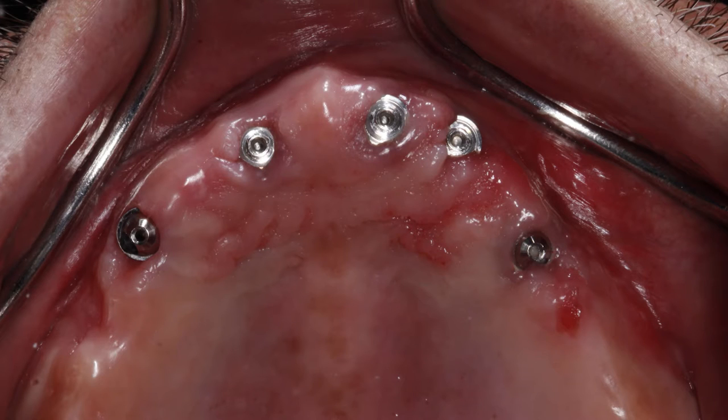This week, I want to go over a couple of concepts that we incorporate into our clinical practice, especially when we're restoring a full arch. In this scenario, we have implants in place — in this case five implants in the maxillary arch — and we also have multi-unit abutments in place as well.